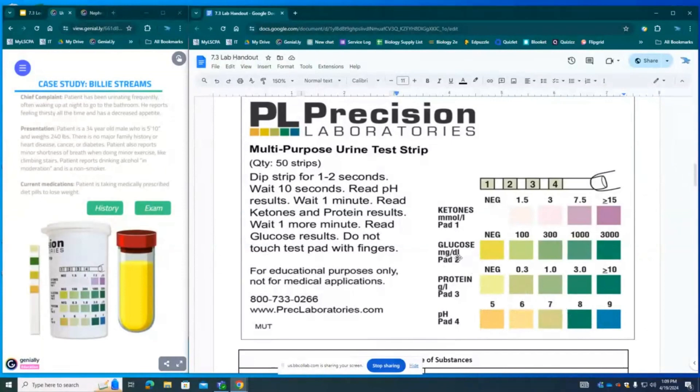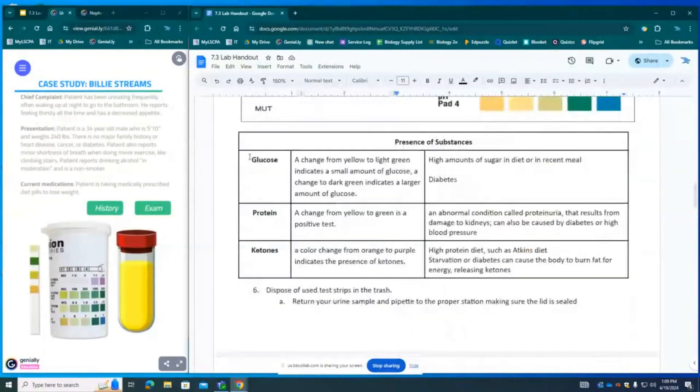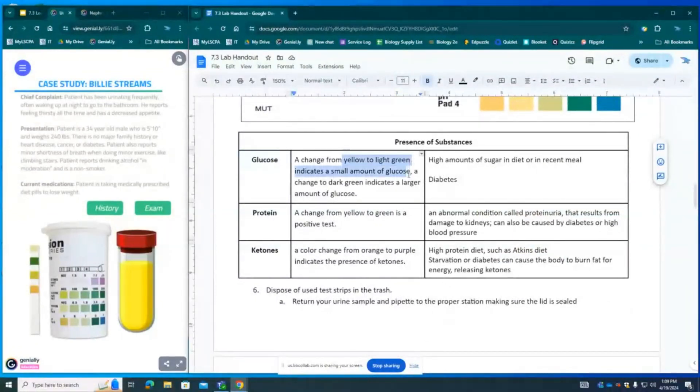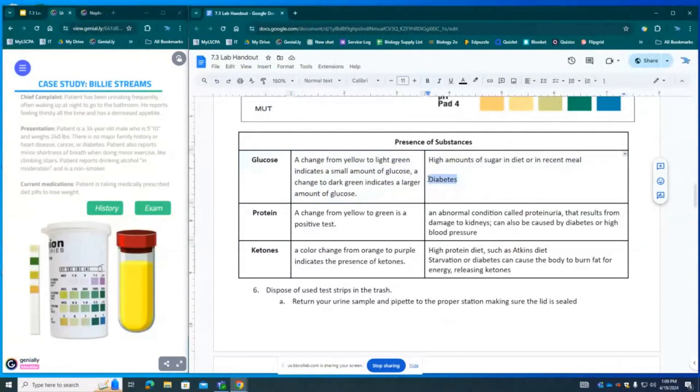So this patient did only test positive for glucose. If we test positive for glucose which means a change from yellow to light green for a small amount or dark green for a large amount. And this is dark green which highly indicates diabetes.